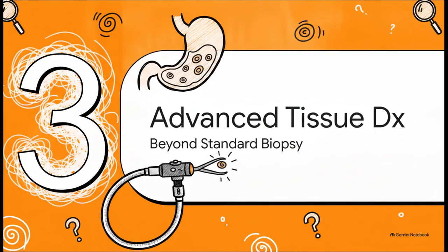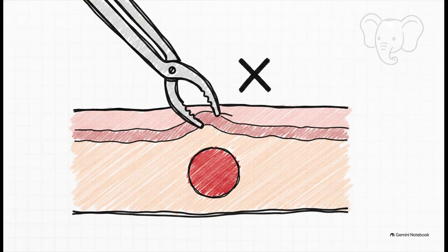Section 3, advanced tissue acquisition techniques. Well, what happens when you do spot a high-risk feature or notice growth? Let's address the elephant in the endoscopy suite. Standard forceps biopsies are just notoriously awful for these lesions. They give you a diagnostic success rate of only 40.6%.